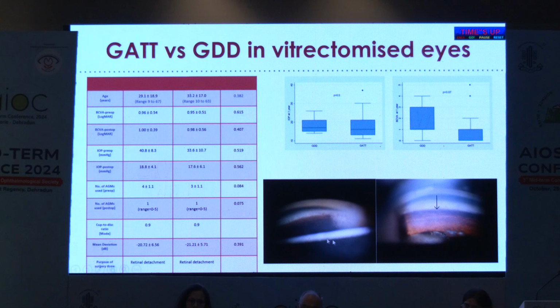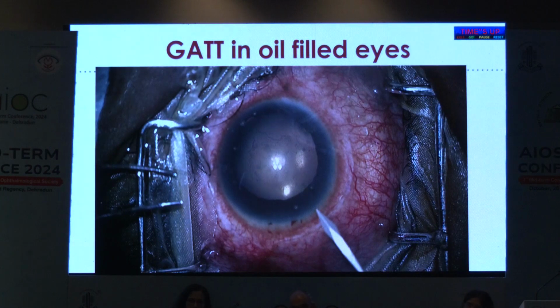Again, this is the emulsified oil bubbles preoperatively. Postoperatively, we can see the incision, and now the oil bubbles are gone. So 2 factors lead to disappearance of oil. Of course, one is that we are doing surgery and irrigating the anterior chamber and aspirating the oil bubbles. But also they may be outflowing through the new tract and the Schlemm's canal that we have just created. So this was one case.